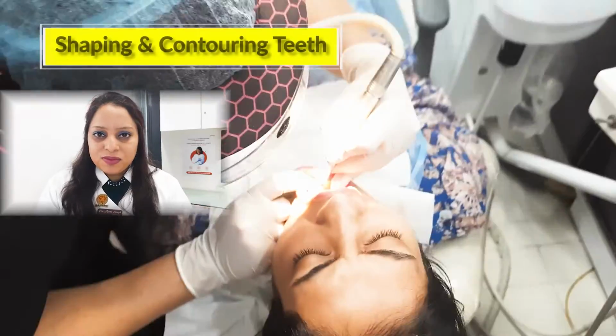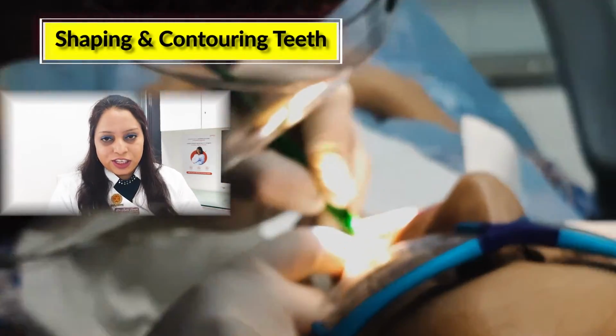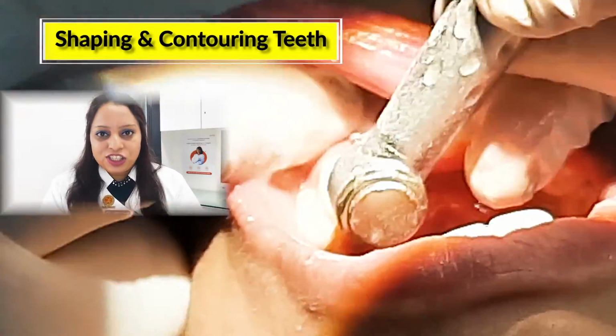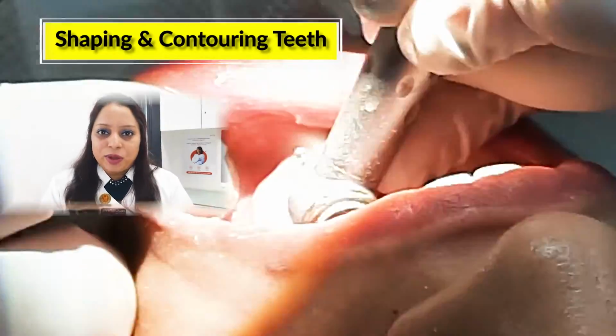As you can hear, the patient is asking for certain corrections and changes in the trial. Now comes the shaping or the contouring of the teeth, and we use special depth gauge burrs so that we can achieve just 0.2 to 0.3 mm of contouring.